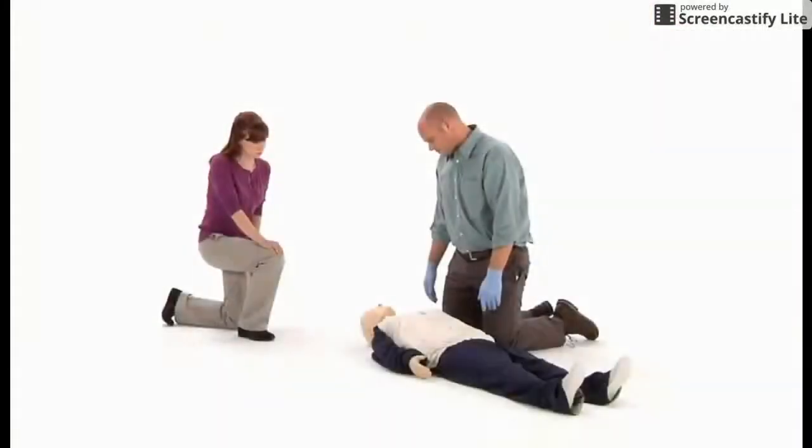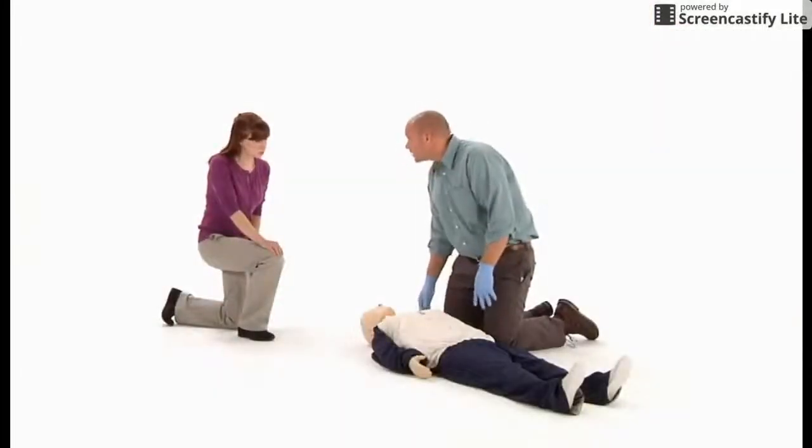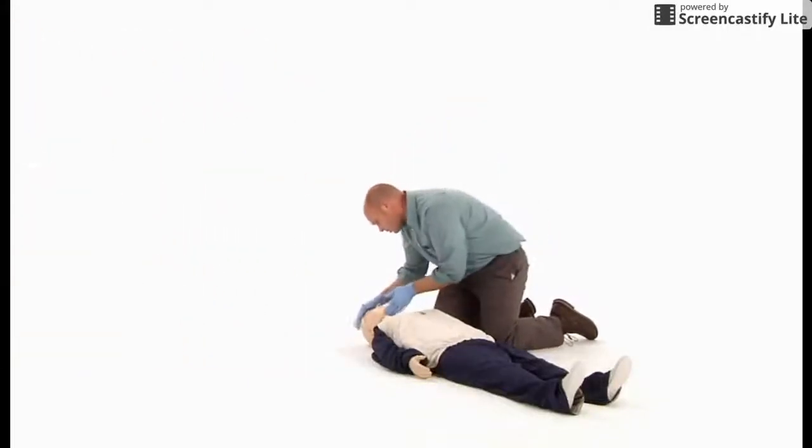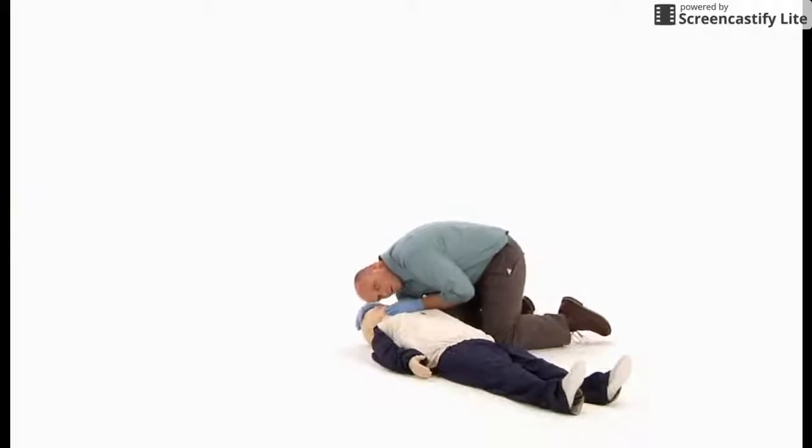Every year, thousands of people die of sudden cardiac arrest. She's unconscious. Go to the front desk, call 911, and bring me the AED. Following the links of the cardiac chain of survival can help save lives. The sooner 911 is called, the sooner advanced medical care will arrive.